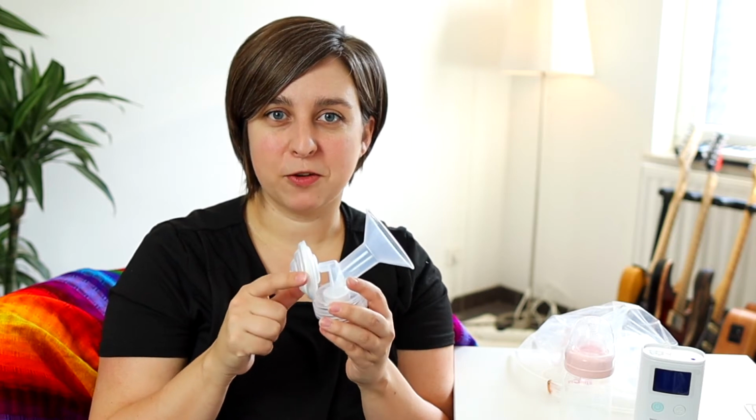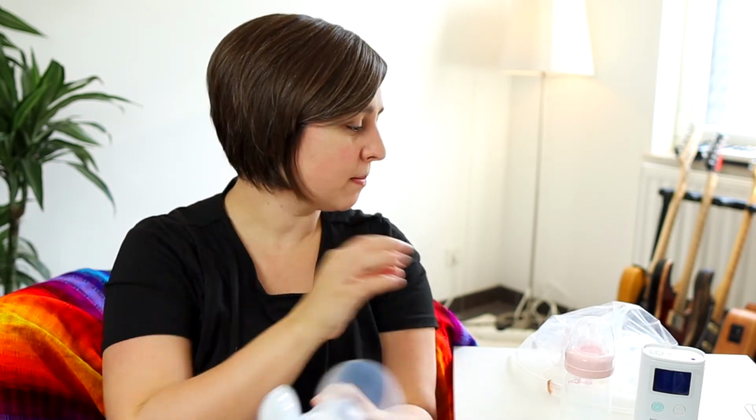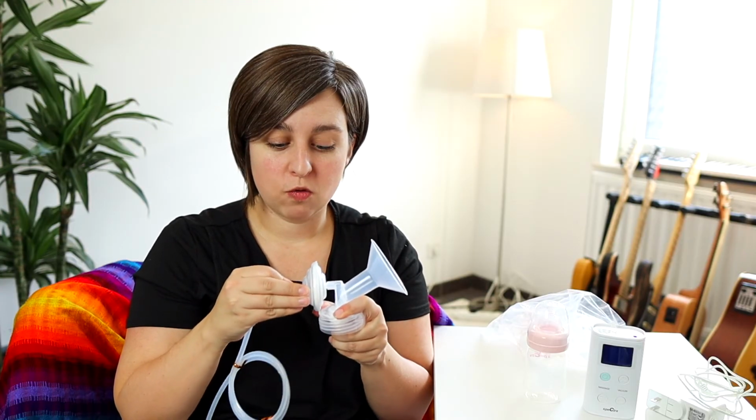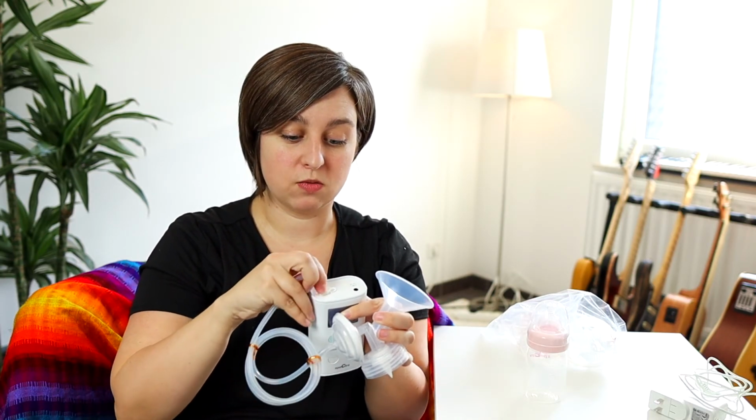This is a closed system, meaning that the pump cannot handle any moisture in it, which is why you have this backflow protector. That's a barrier between your milk and the tubing that goes to the pump. So you should be getting no moisture in your tubing. You also should not be washing your tubing because any kind of moisture that gets in there is going to ruin your pump. So don't wash your tubing.